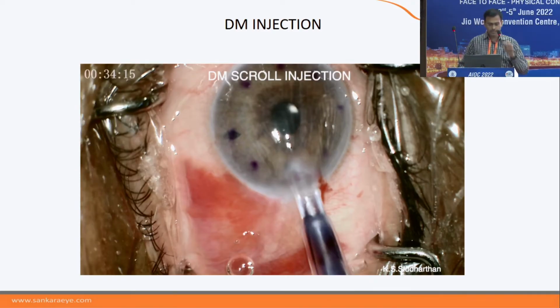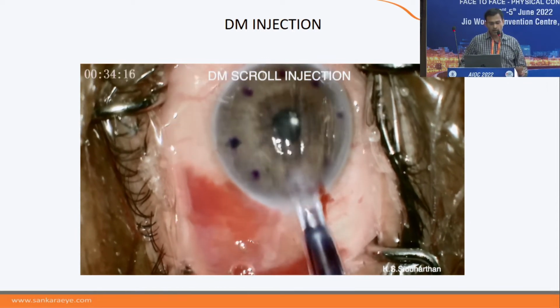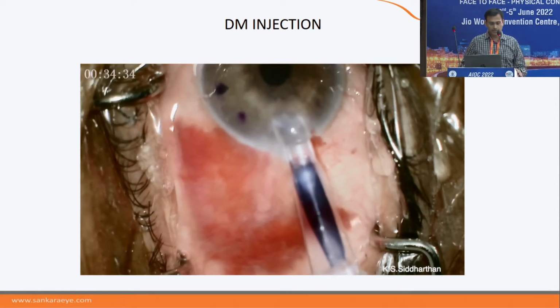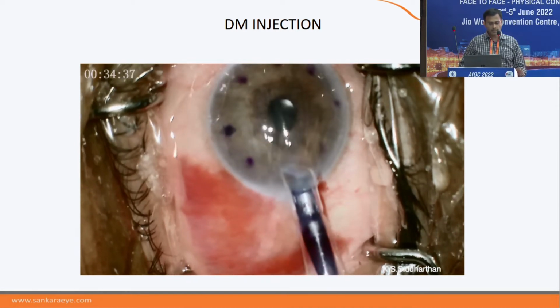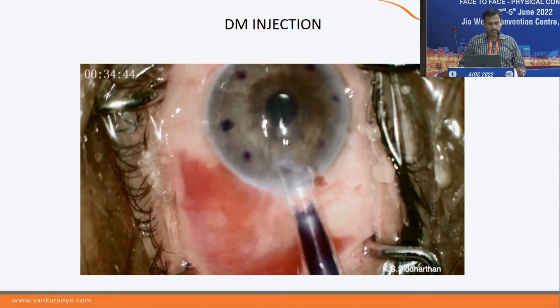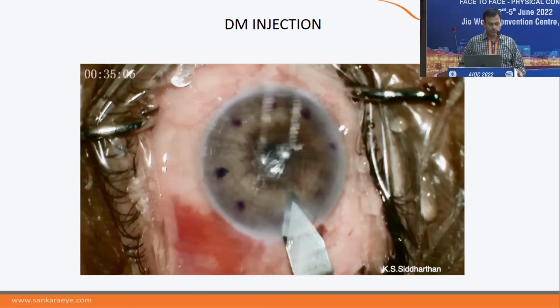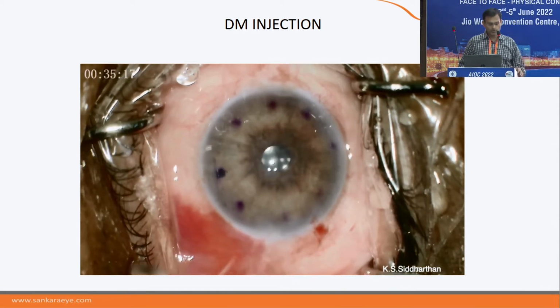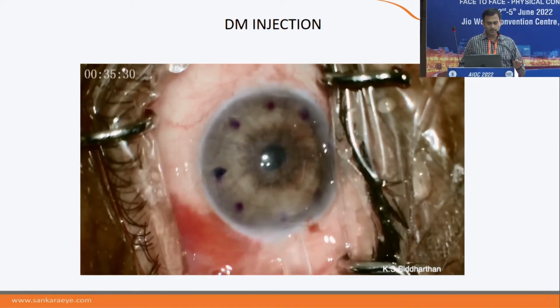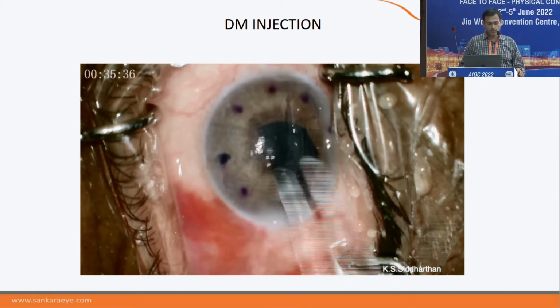Starting with the DM scroll injection, the size of the tunnel is very important. Here, as you see, I am trying to inject air, I inject saline, I am trying to inject the tissue, and it is not going in. It's not that I am using a different amount of suction, but you can see I am injecting saline, thinking that the iris is coming and plugging it or something is happening. A very simple thing is, when you feel this, just slightly extend the incision from 3.2 to slightly more, and try to reduce your positive pressure when you inject. Just adjusting the speculum and the size can easily allow the DM to enter.